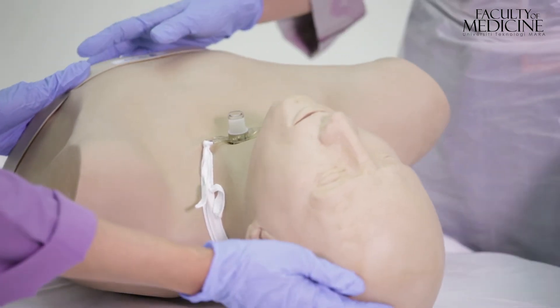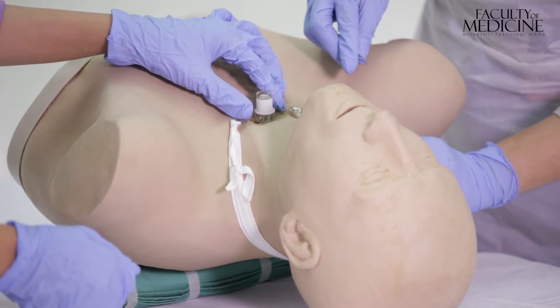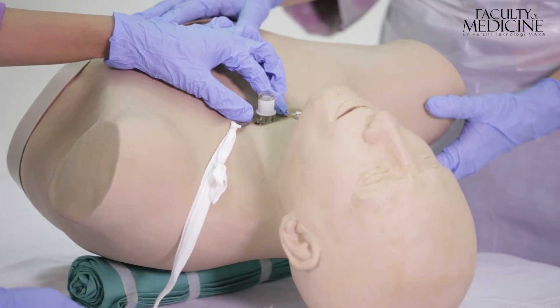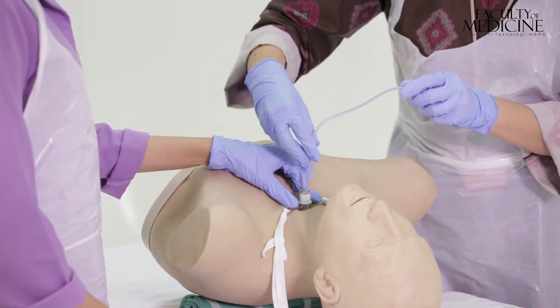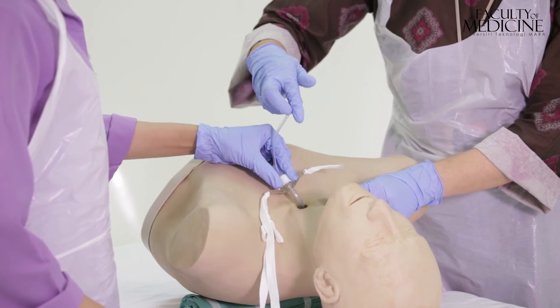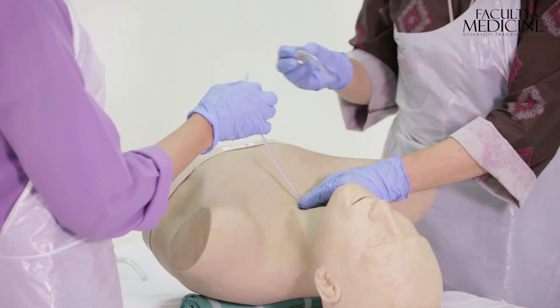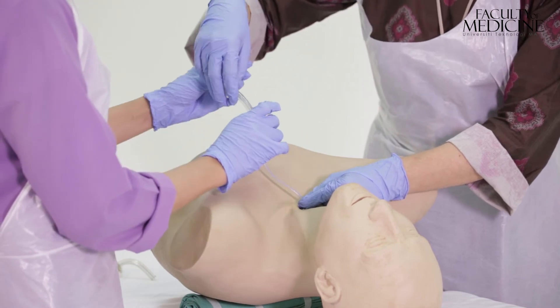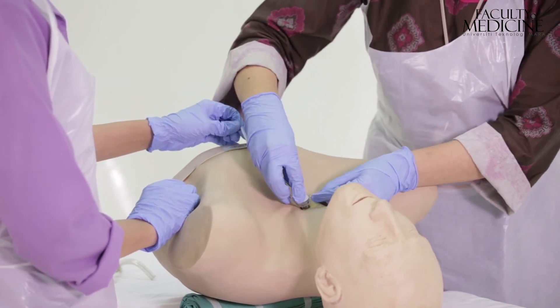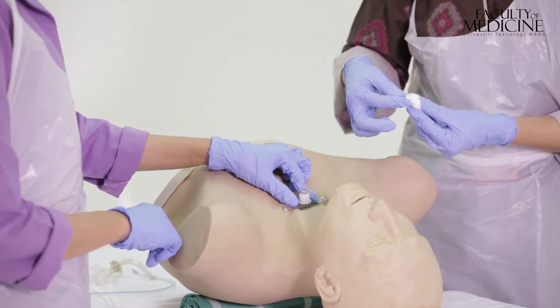The patient is positioned lying supine and a sandbag is inserted underneath the shoulders with the head and neck extended. A blade or scissors is used to cut the ribbon tie. The nasogastric tube is inserted beyond the tip of the tracheostomy tube — the patient may cough at this point. The tracheostomy tube is then slowly and carefully removed, ensuring that the nasogastric tube is not removed from the airway along with the tracheostomy tube. The new tracheostomy tube is then fed through the Ryle's tube into the airway. The nasogastric tube is then removed and placement is confirmed using a cotton wool to check for airblast.